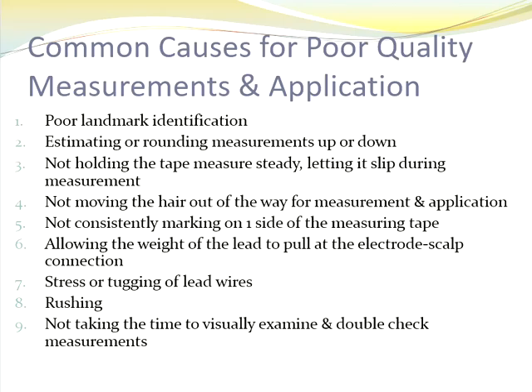Make sure you're holding the measuring tape steady to where it needs to be and that you're not letting it slip or slide, because accurate measurements are so important to the accuracy of the test that we're doing. Make sure you actually part the hair. You don't want to measure over hair, especially people that have really fluffy hair. We're trying to find the scalp measurements, not the hair measurements. So we do part the hair to make sure that the measuring tape lies as flat to the scalp as possible.